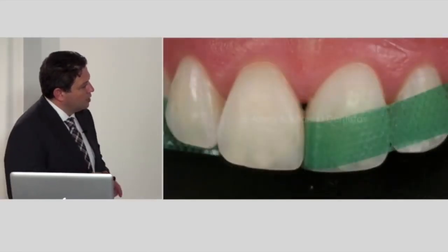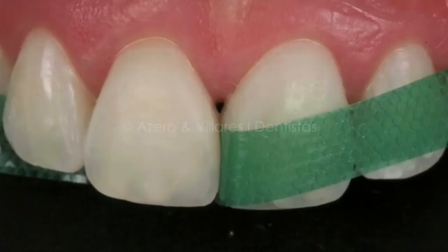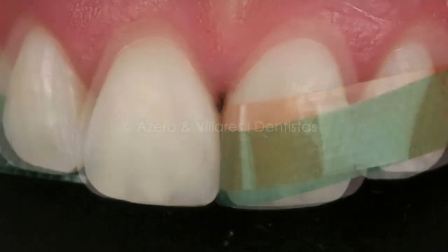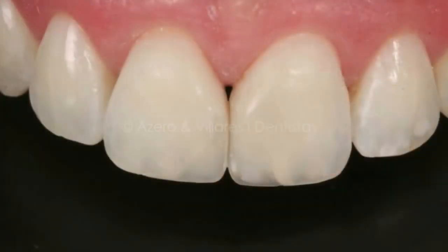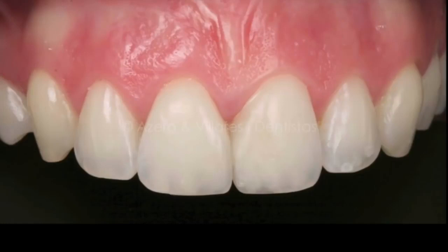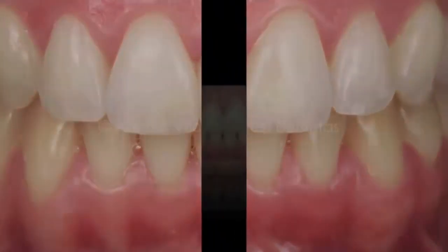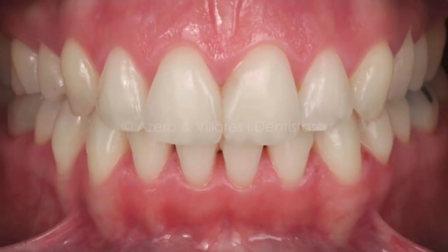Then we use this type of strips to polish the interproximal part. These are the Epitex ones. The advantage is that they don't eliminate too much of the anatomy of the teeth, and we use them at a very slow speed to have a very good shape, in different grades. This is the immediate result, and the most important thing is to check the cases afterwards. This is prior to the whitening in the lower incisors, and this is the review when we did the whitening there, and we have a very natural restoration that integrates in the mouth.